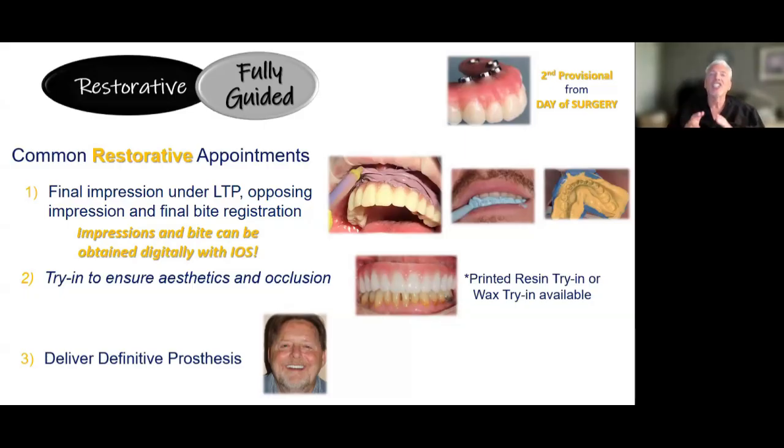This is what patients are judging you by when they hold. They're not just gonna hold the mirror out here like this and go, yeah, that looks really good, thanks. They're gonna hold their mirror like this, and they're gonna do this, and another mirror here, and they're gonna do this with their lip. So, you know, we can really make these quite nice.